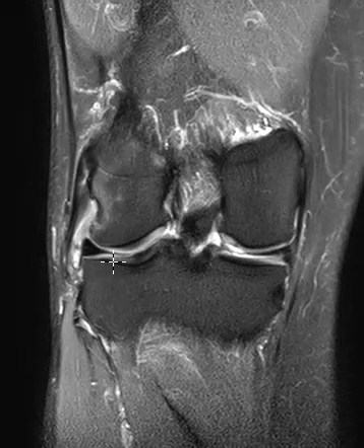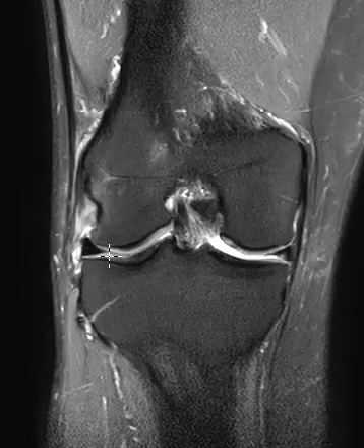If we look over here on the lateral side where they're having their symptoms, the lateral meniscus looks great — nice lateral meniscus.